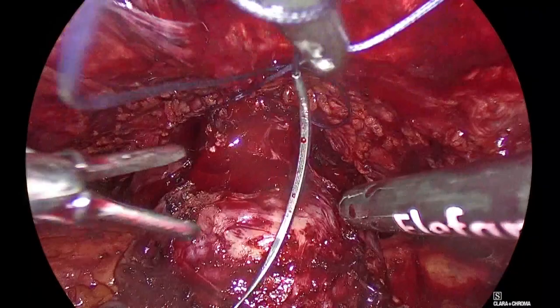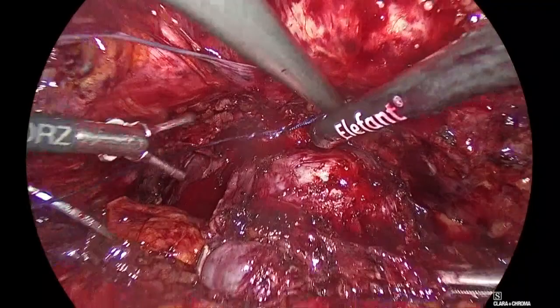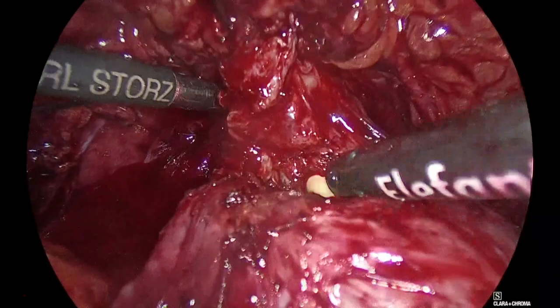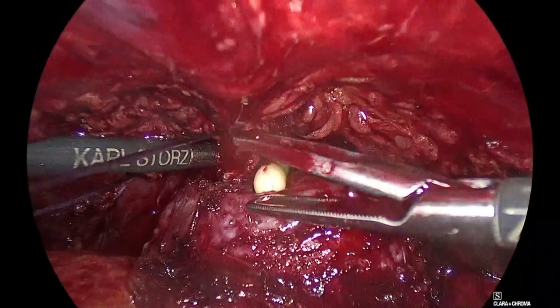Three. I missed it? No, it's fine. Go back, Badeli, back. Panagiotis, no, no, not yet. Come in, Badelis. Panagiotis, pull. Aspirate and pull. Exactly, there. Good, okay. Aspirate inside. Pull the catheter, please. Good, it's okay. Push it in. Good, it's fine. Come, Panagiotis, hold it there. Good. Go back.